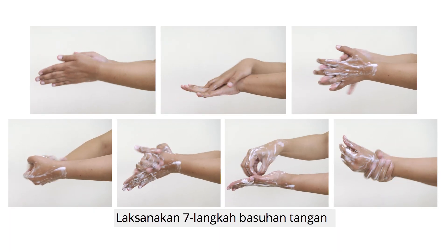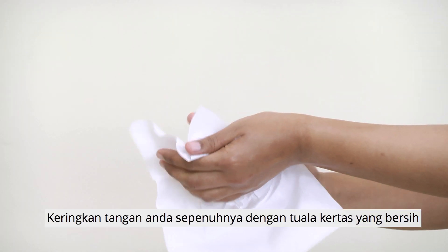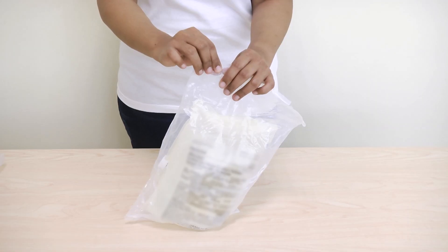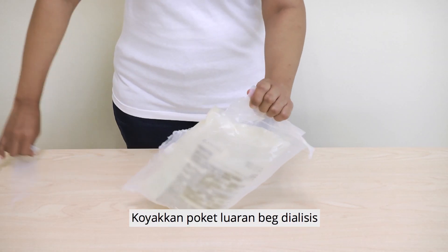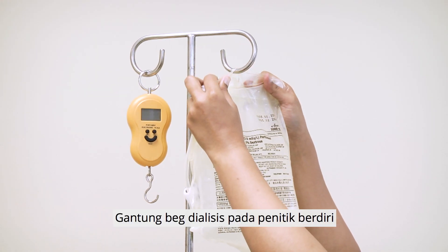Perform the seven-step hand washing, then dry your hands completely with a clean paper towel. Tear the outer pouch of the dialysis solution and hang the dialysis solution on the drip stand.